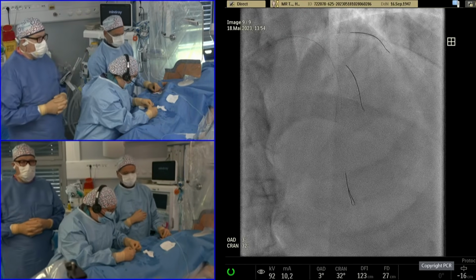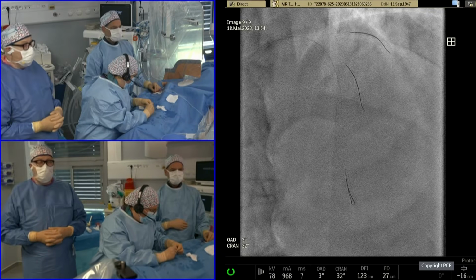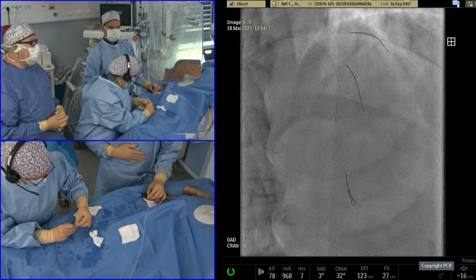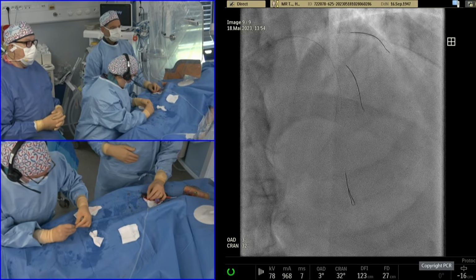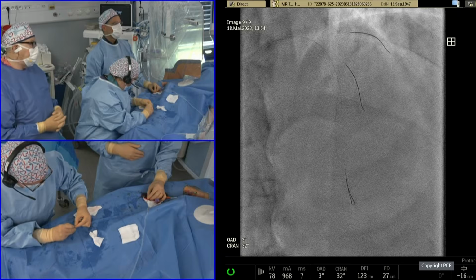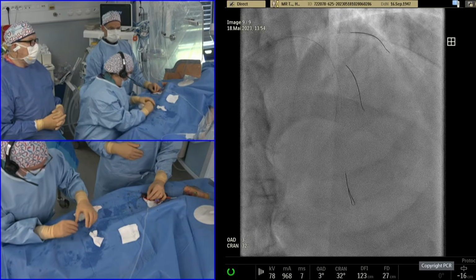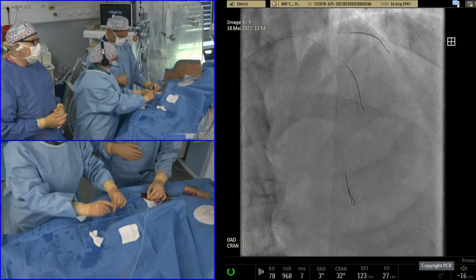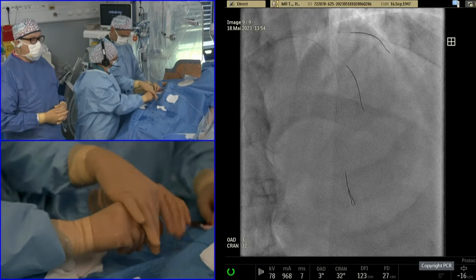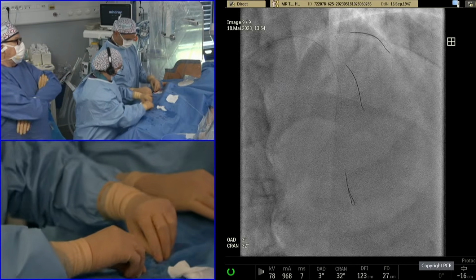Well, yes, there have been some questions. One was, why do the imaging if you've done the CT? We have information, and I think we have to see that as complementary. So the CT was diagnostic to get the patient to the cath lab. And now we have this incredible information from Yoshi. I must say, I thought the left main was moderate and may not be significant, but to have reached an MLA of 4.4 quite clearly demonstrates the significance of that.